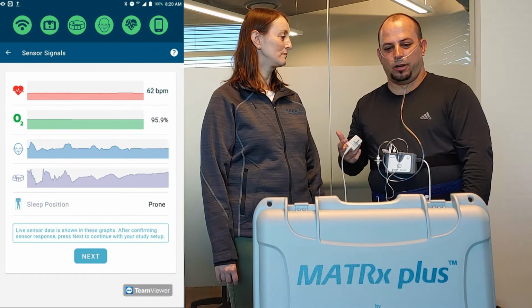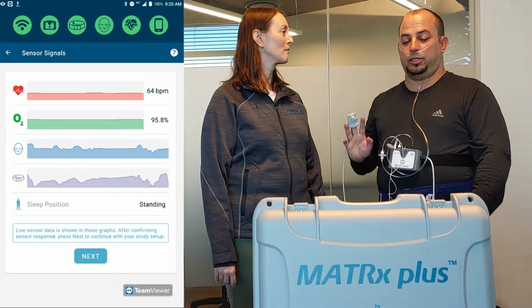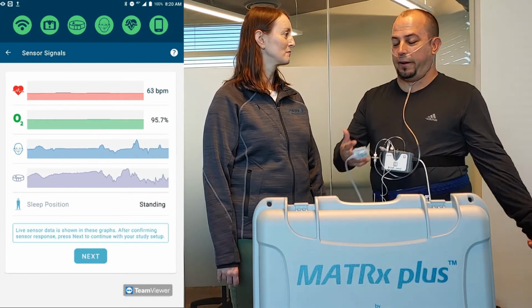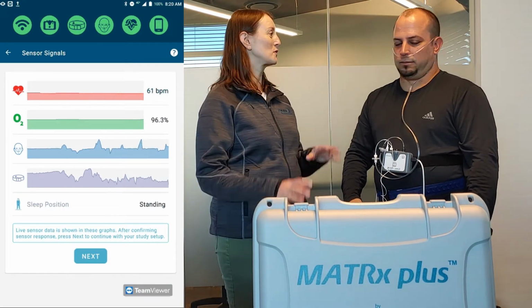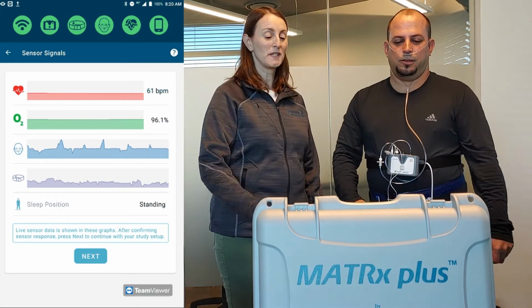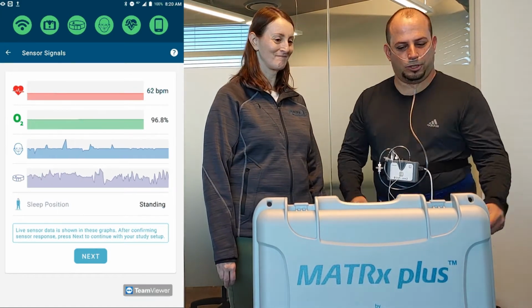Okay, so I've started putting on all my sensors. I've got all my icons green, as you can see, and I can see that I'm ready for my study. So now I can go to bed. No. You need to go a little bit farther in. This screen is just to help you see that the sensors are working. But if you read at the bottom, it does say to press the next button. Great, I'll push next now.